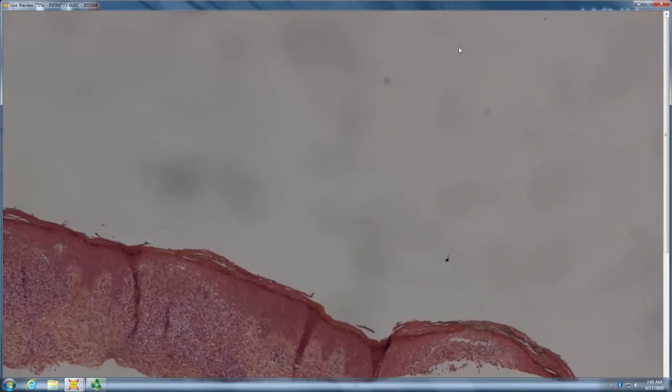Like the histiocytic disorders like LCH and mastocytosis. Usually those aren't interface. Okay. So interface, lymphs with too much cytoplasm, you have to think of syphilis, correct? You always have to think of syphilis, right?